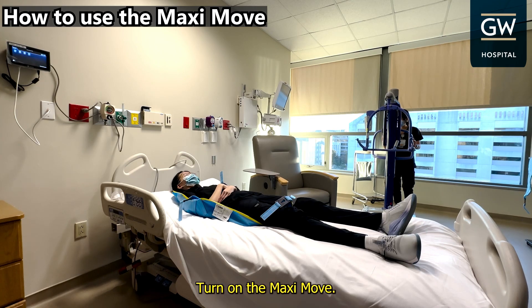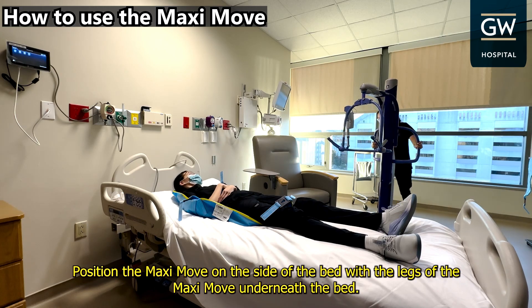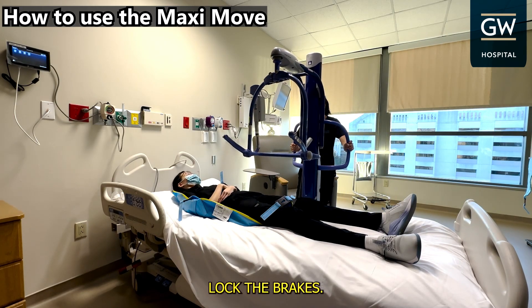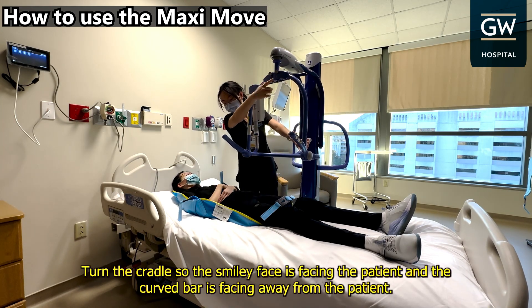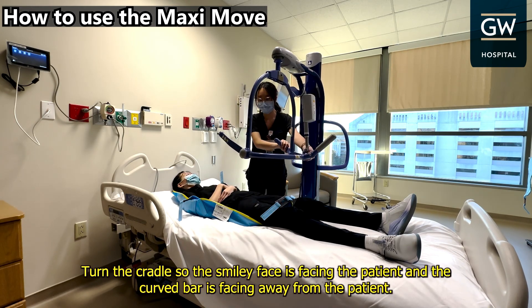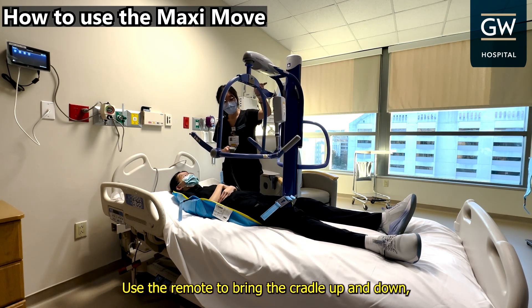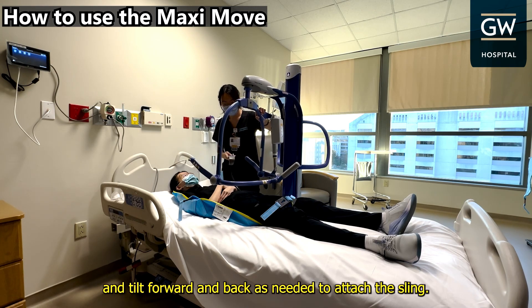Turn on the MaxiMove. Position the MaxiMove on the side of the bed, with the legs of the MaxiMove underneath the bed. Lock the brakes. Turn the cradle so the smiley face is facing the patient, and the curved bar is facing away from the patient. Use the remote to bring the cradle up and down, and tilt forward and back as needed to attach the sling.